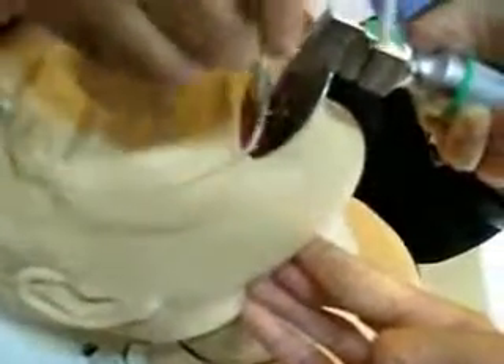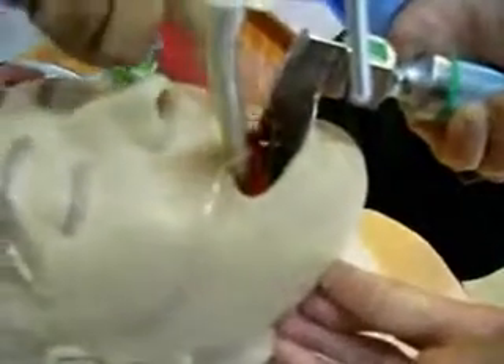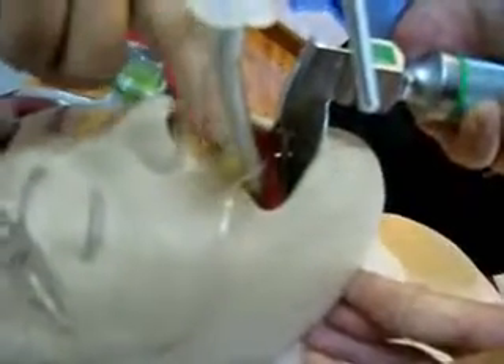Maintaining the forward and upward thrust, you can now insert the endotracheal tube into the laryngeal opening. The tube can be inserted up to the mark of 19 or 20, which is labeled on the endotracheal tube.